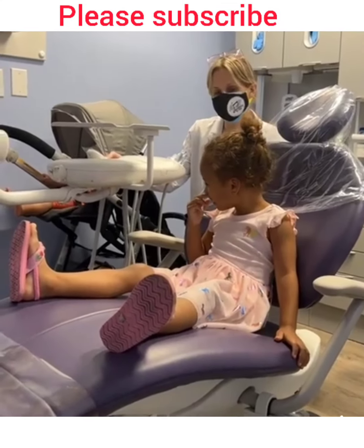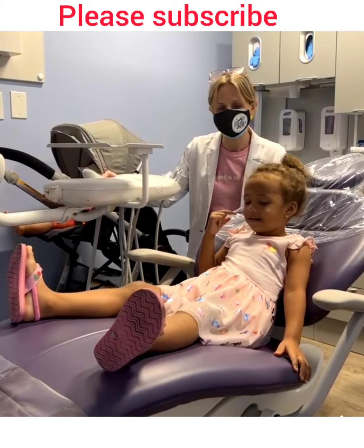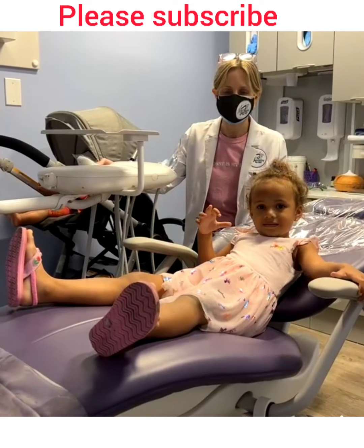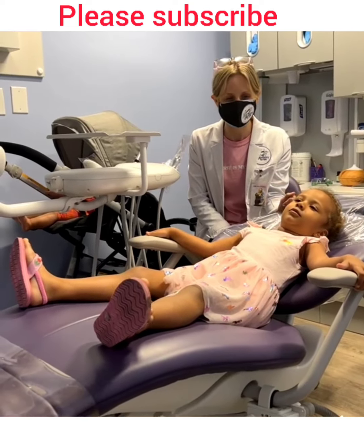We take a little ride backwards because it's easy for me to see. You're laying down a little bit — ready? One, two, three. Perfect! Very good, you can lay down back like this, yes.